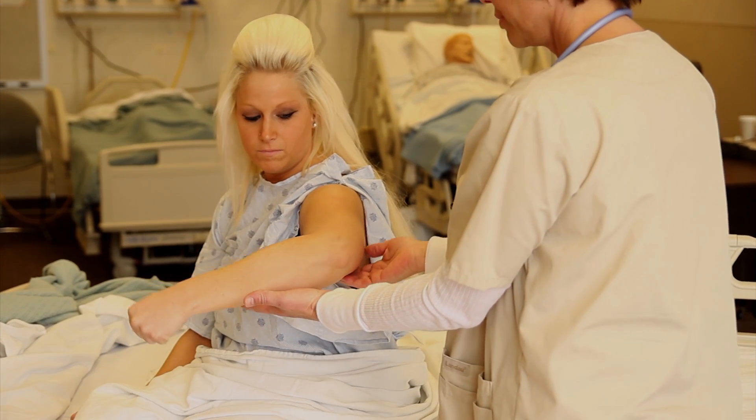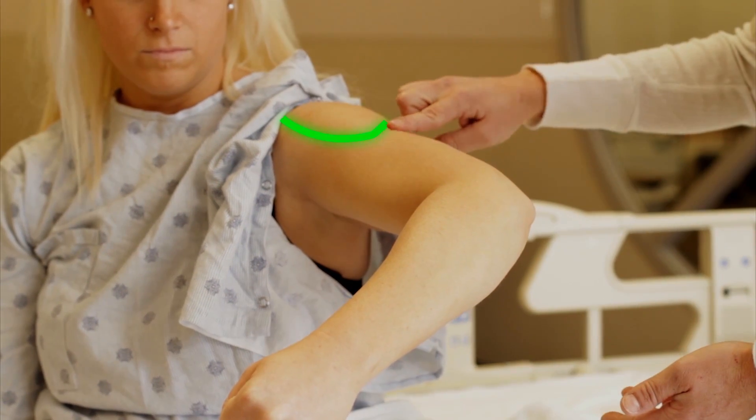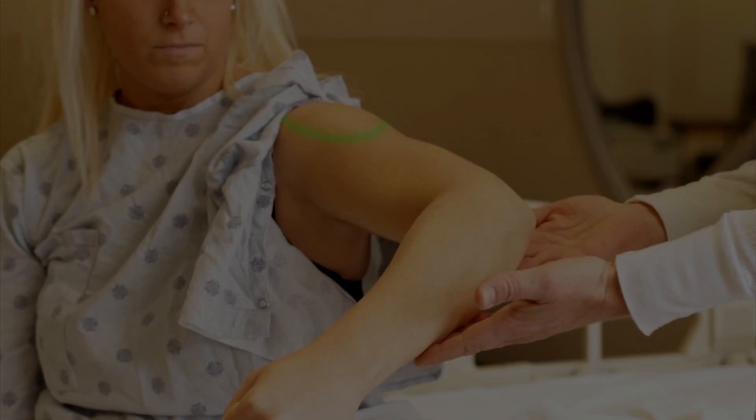To make the deltoid more visible, have the patient make a fist and raise their elbow slightly.